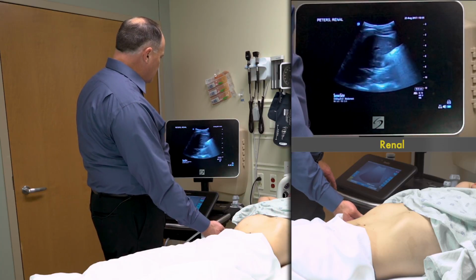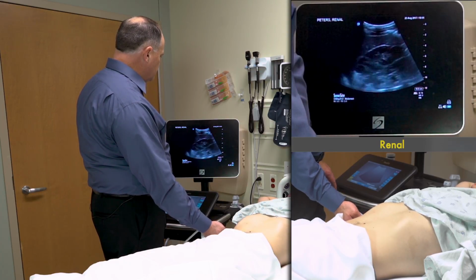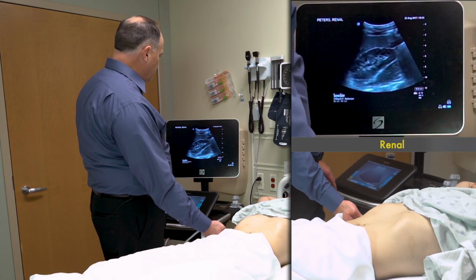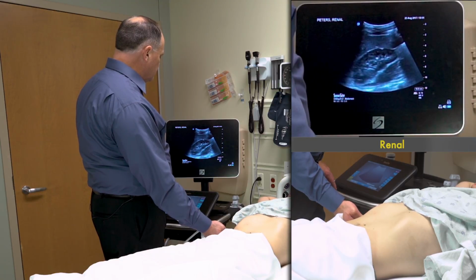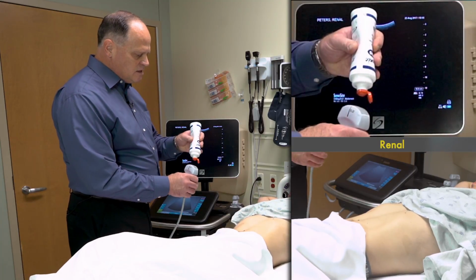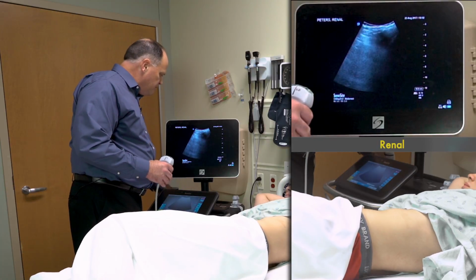So that's the scan of the right kidney. Again, I don't see any cysts, I don't see any pathologic parenchyma, and the renal pelvis, as expected, appears normal. There's no hydronephrosis here. Moving on over to the left kidney, it becomes a little more challenging to us because that kidney is more superior, more posterior.